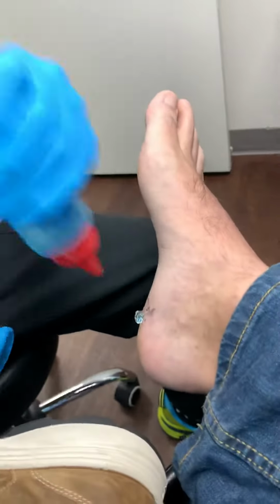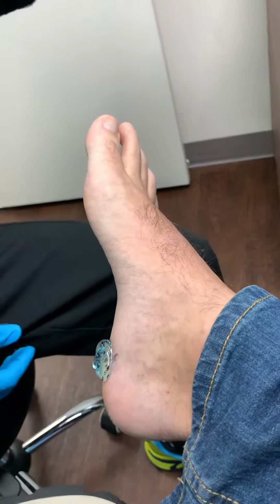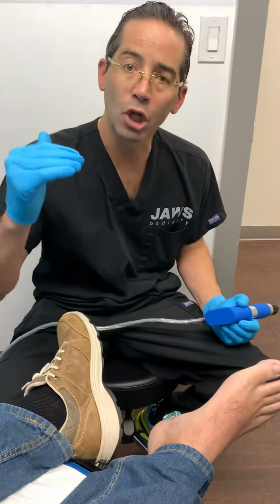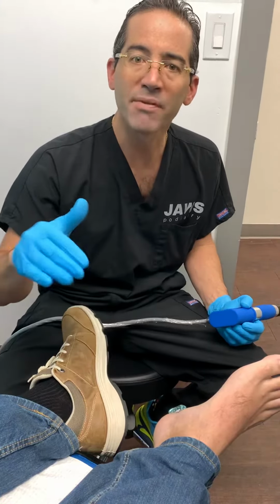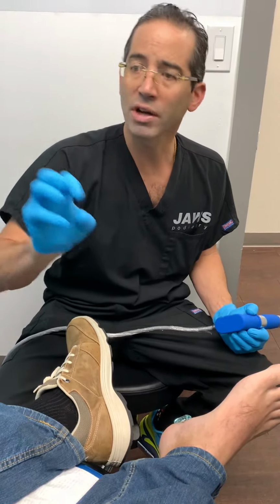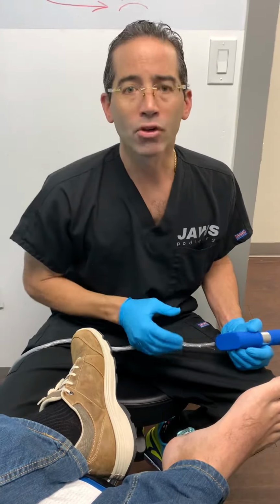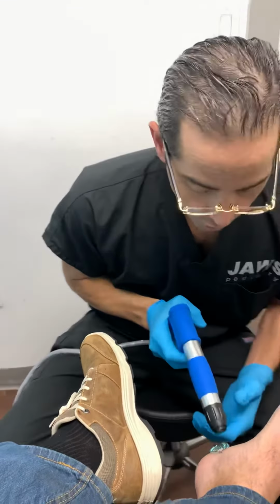What we basically do, I tell the patient, is put a little bit of this coupling gel there, and we'll start. I usually tell the patient that we'll start at a lower level, and there's a numbing type of effect, in lay terms. We'll start low, and I'll ask the patient how they are feeling. The patient will let me know if they feel a little discomfort, and what the patient tells me will dictate what parameters we can go to. Okay, so without further ado.